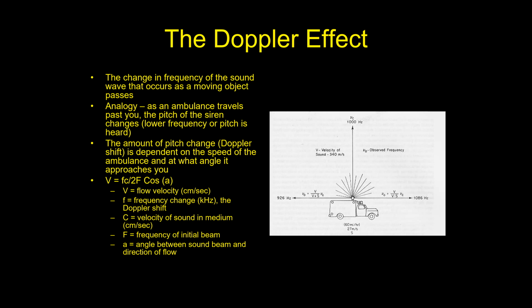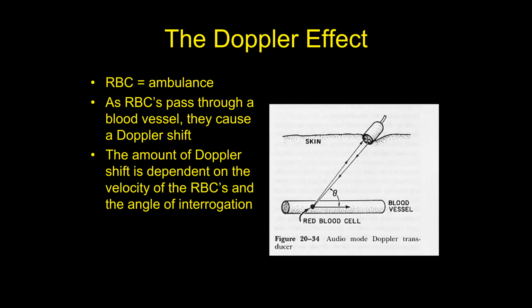Now, in our bodies with ultrasound, we don't have trains and we don't have train tracks, but we do have moving particles. So what the Doppler ultrasound looks at, instead of trains, is red blood cells. It's sound waves that are bouncing off red blood cells in our veins and in our arteries. That's what we're experiencing when we do color flow. So now we have this, which is you sitting here in your lawn chair.